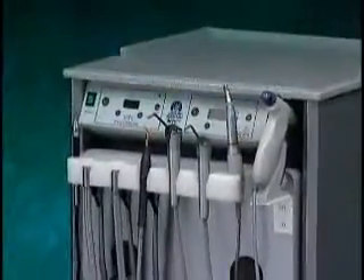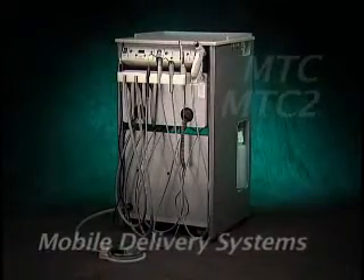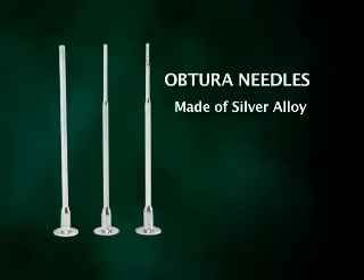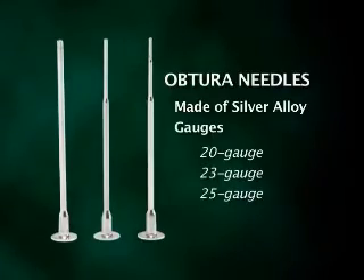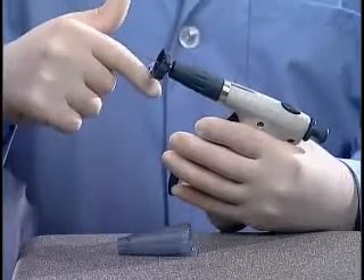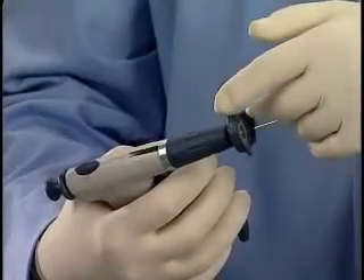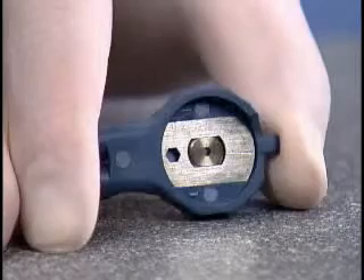The Obtura unit is also built into the MTC and MTC2 mobile delivery systems. The Obtura applicator needles are made of silver alloy for its efficiency in conducting heat and its ability to be bent to various angles. You have your choice of three needle diameters to suit your needs. The needle is simply attached to the Obtura gun before it's heated using the new multi-tool. The needle is placed into the needle nut and the nut is then tightened with this tool.